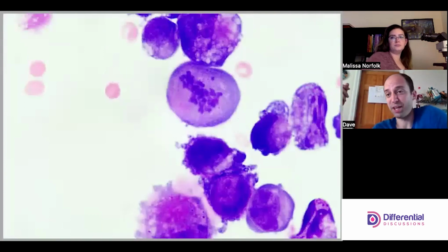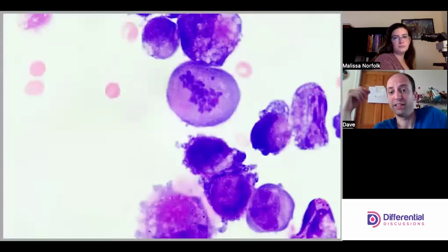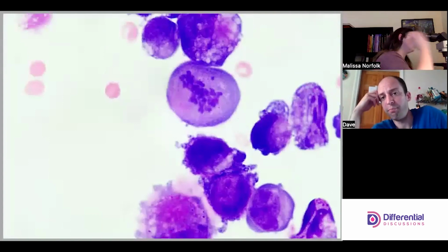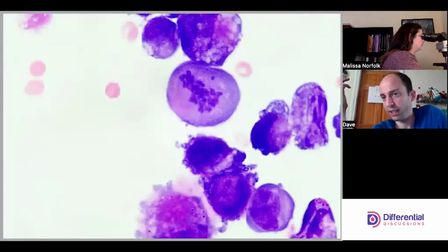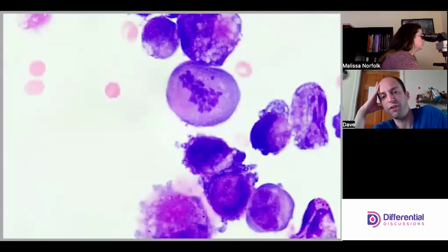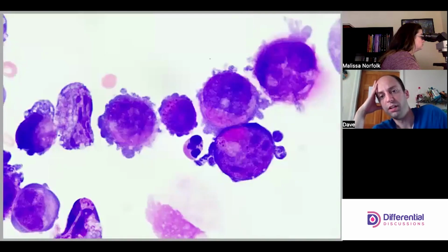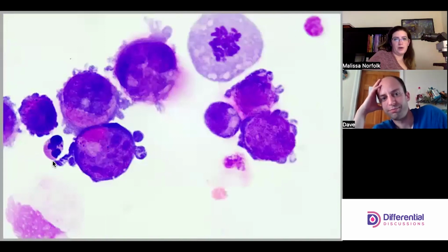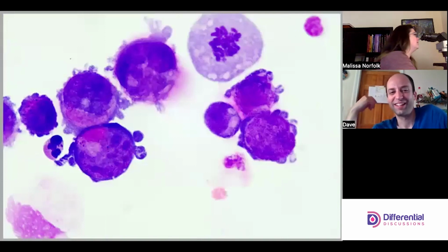So now we have mitotic figures. Depending on the lab that you're in, that's a somewhat significant finding. It doesn't always suggest malignancy. The normal lining cells go through mitosis; that's how they keep tissues functioning and replace themselves. But even the mitotic figures in that cell looked abnormal. There's another one. I'm wondering if that might have been a normal one. Maybe. Kind of hard to tell.